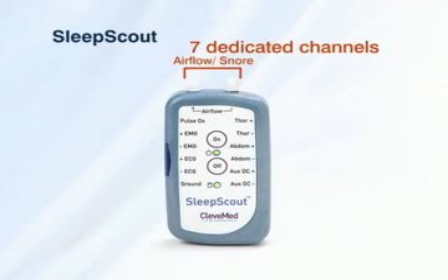Dedicated channels include pressure-based airflow, snore, thoracic effort, abdominal effort, body position, and an auxiliary DC input for a thermistor.